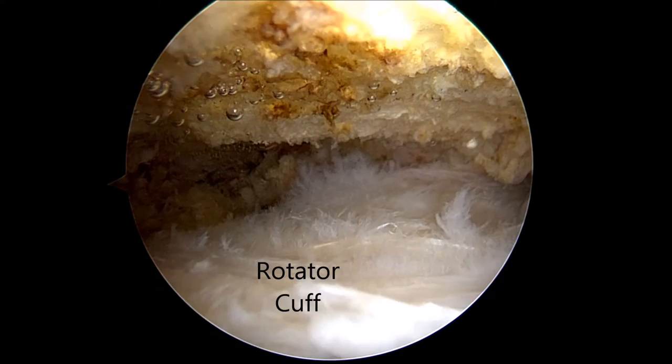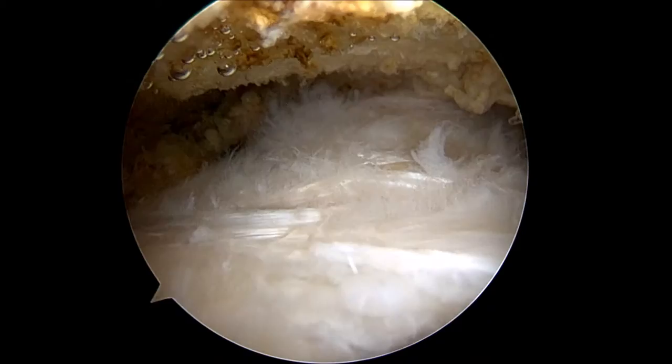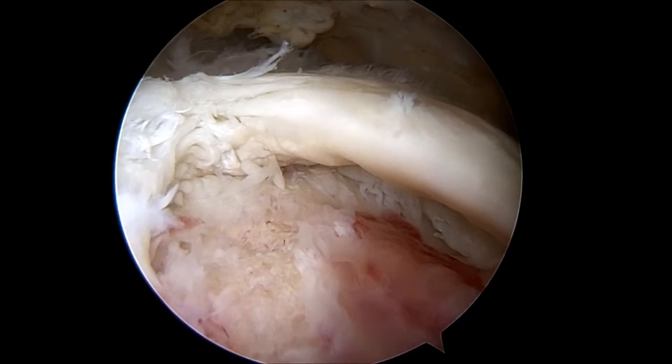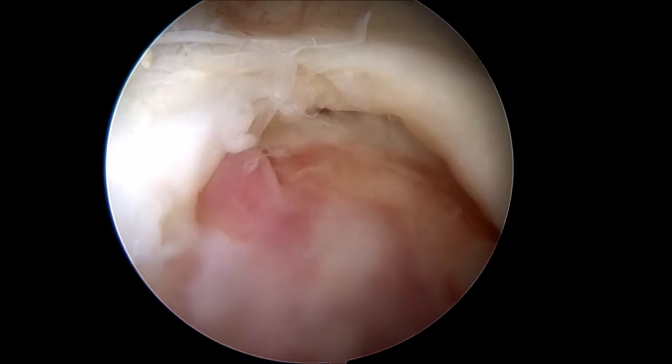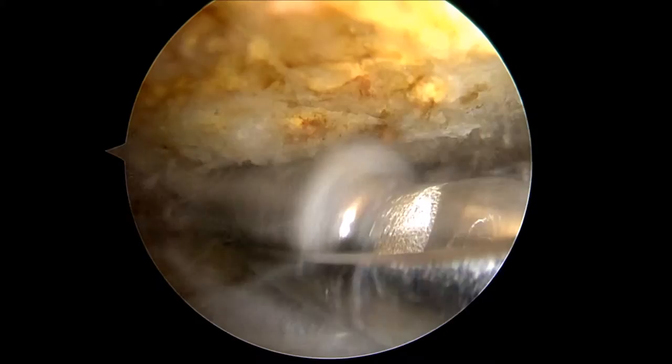The rotator cuff is the white soft tissue seen on the bottom portion of the monitor, while the acromial bone is the yellowish area seen on the top of the monitor. As the camera view is wide, you can see the torn rotator cuff tendon as it is detached from the bone. Here is a nice view of the torn rotator cuff tendon and the exposed underlying bone. Next, an arthroscopic burr device is inserted to flatten the undersurface of the acromion and remove any curved bone or bone spurs in this area to prevent future impingement on the rotator cuff.